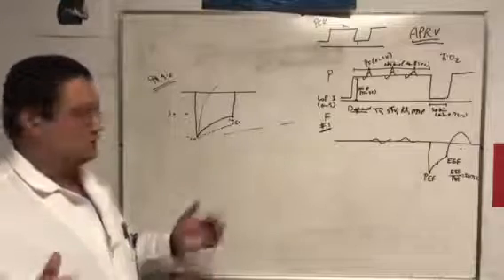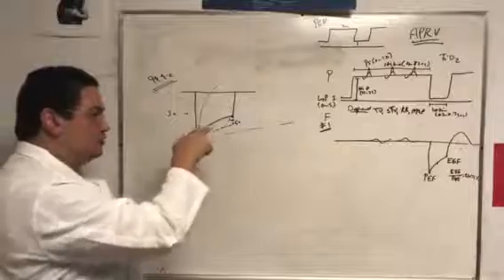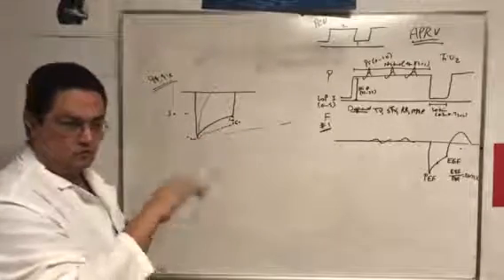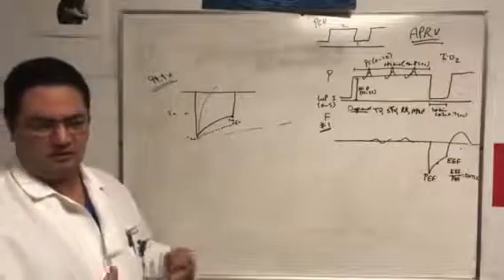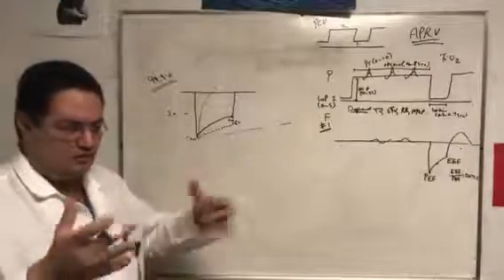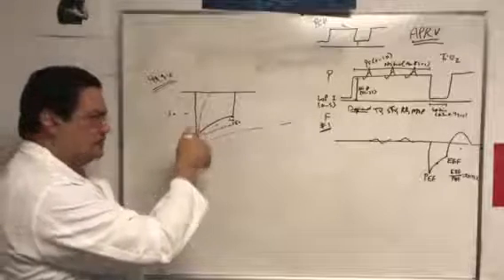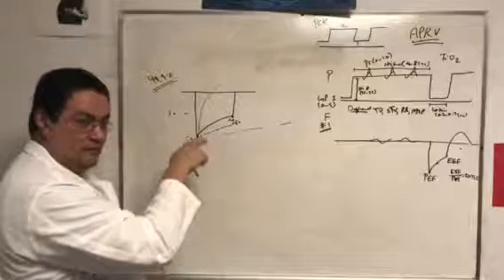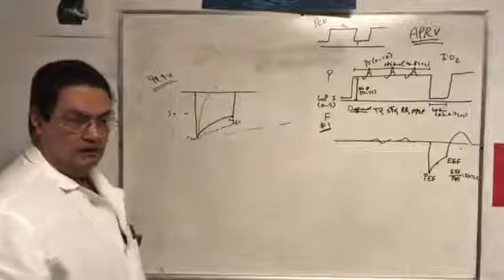Very low compliance, right? So 99% of the time, it is actually due to improved compliance of the patient, which is low. Did I say low compliance? Yeah. High compliance. The COPD has high compliance. Like lungs are easy to inflate, right? So what I'm saying here is that the majority of the time, that's what happens in the APRV, is that they recruit more and they become more compliant.